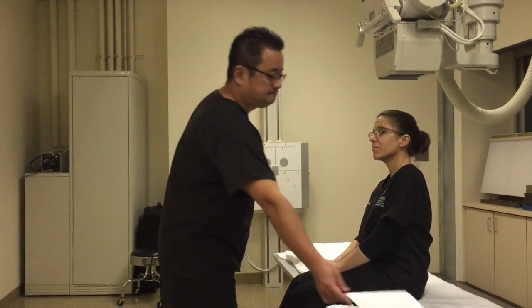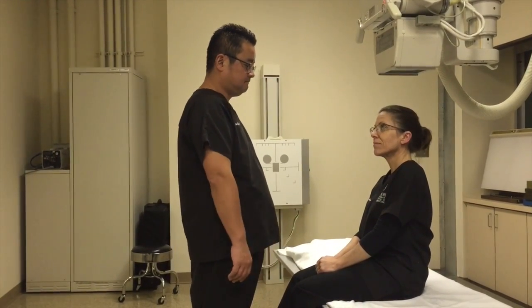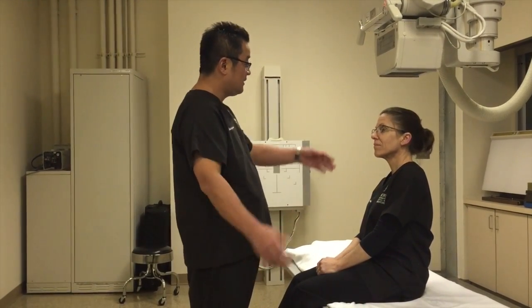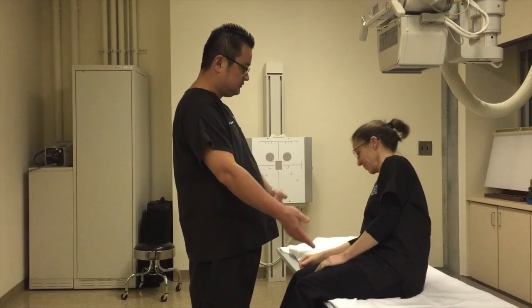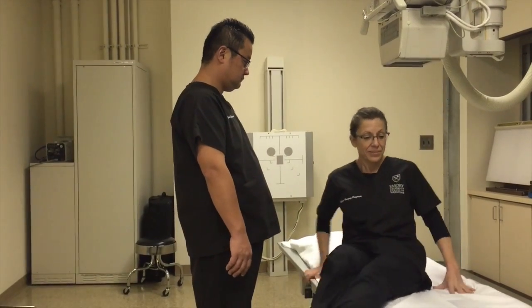Next, the technologist will take a scout KUB, then take it to the radiologist before proceeding with the exam.